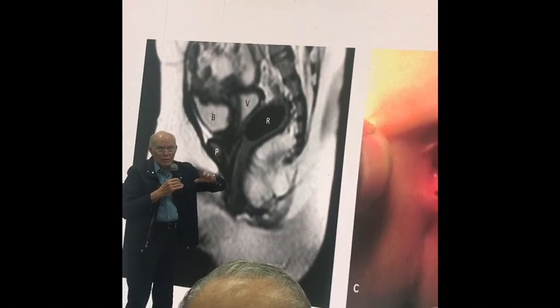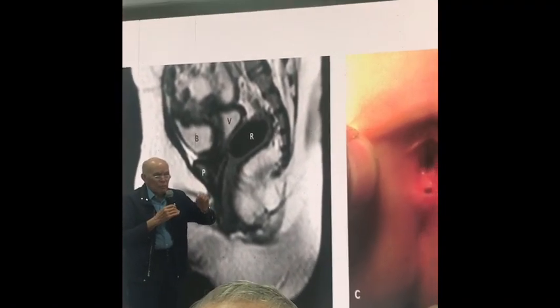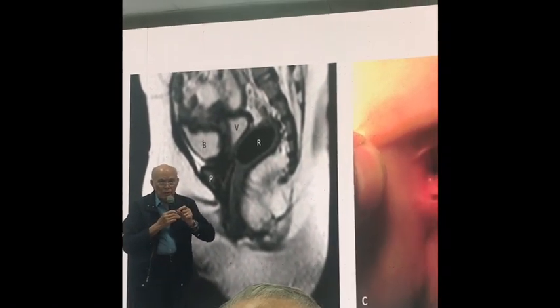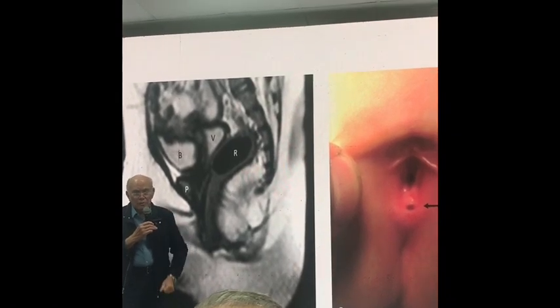First of all, we don't do that classification. High, intermediate, and low is useless. We go by specific defect with specific characteristics, because what you want to know is how you are going to operate, what approach we are going to use, and what the final prognosis of the patient is.